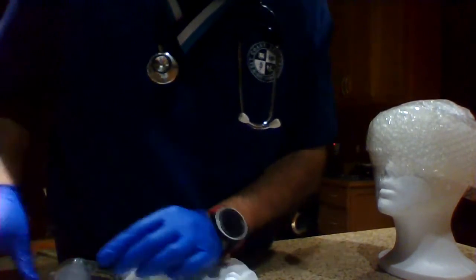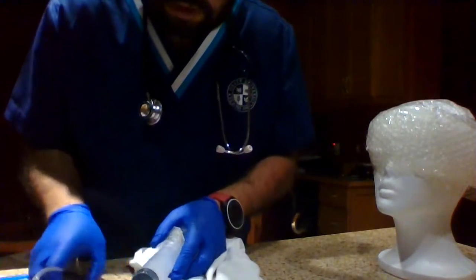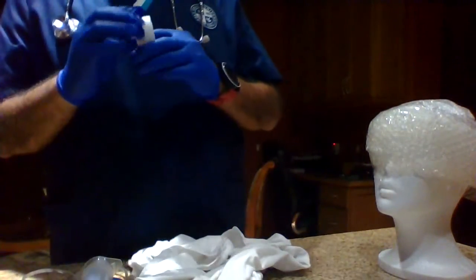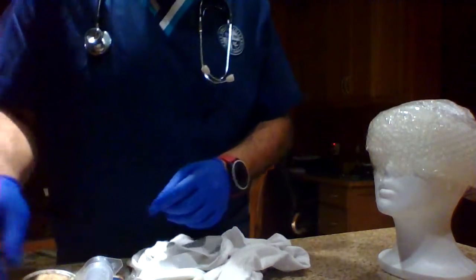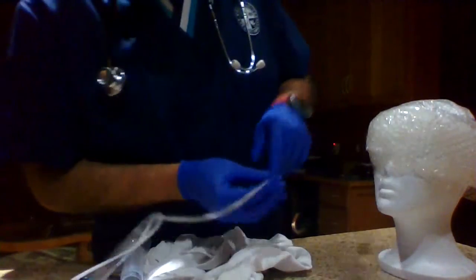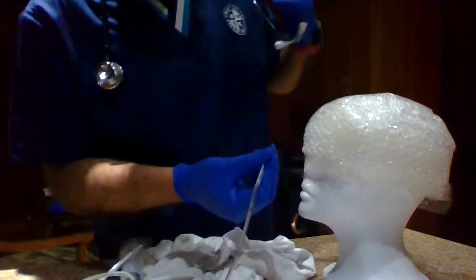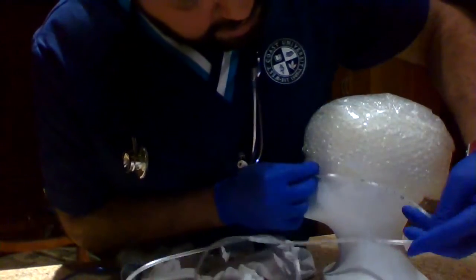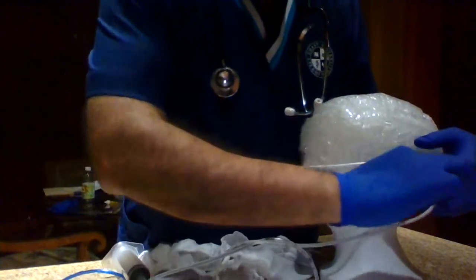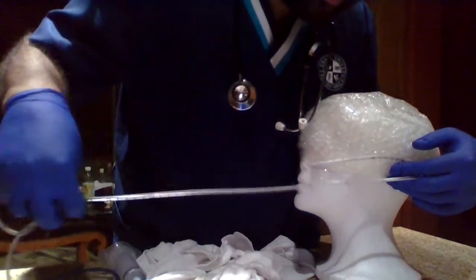So now what we have to do is measure the NG tube, and I have my tape over here. I'm not going to tape it, but you would have your tape, because I'll explain why you need this. So what you're first going to do, let's move this over here. You're going to measure from the nose to the ear, and then you're going to measure from the ear to the xiphoid process.